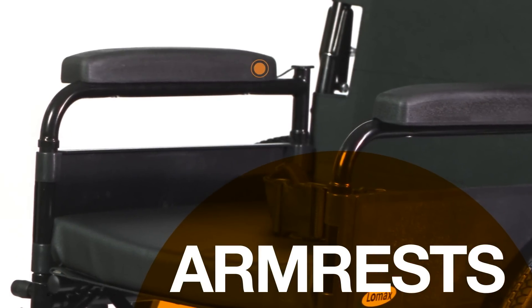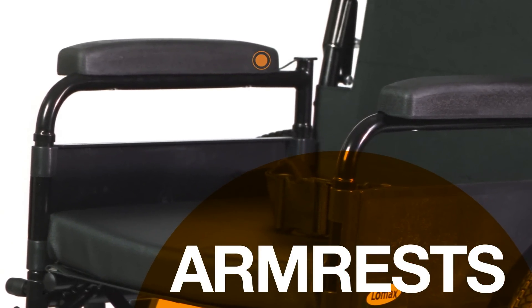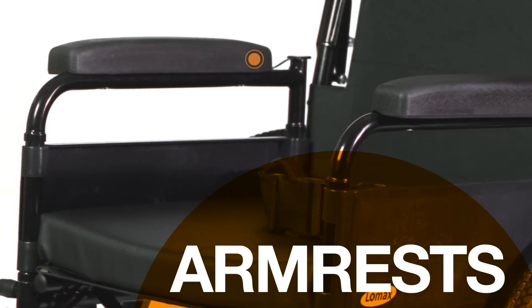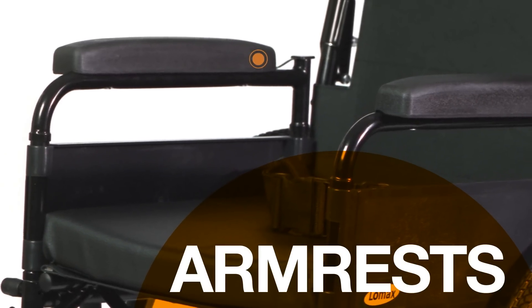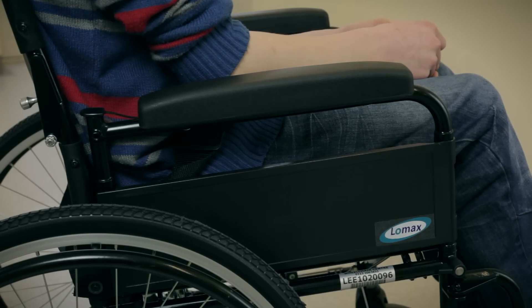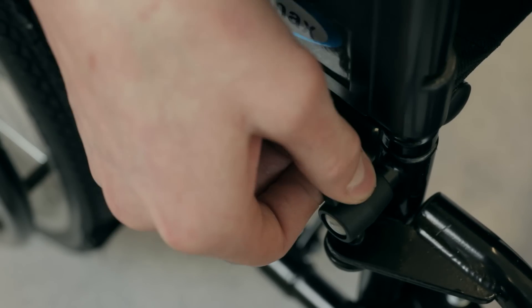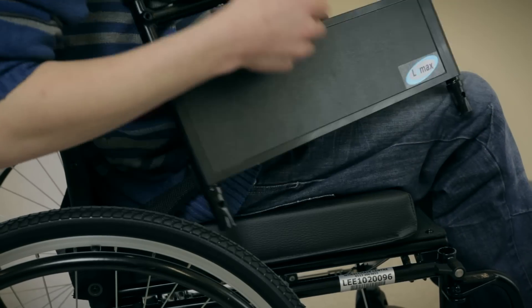Most wheelchairs have detachable armrests. These can be removed if you need to transfer sideways into or out of the chair, or to sit at a table. You remove the armrests by pressing this lever at the front side of the chair and lifting the armrest out from its sockets.